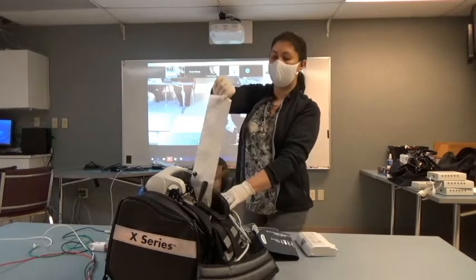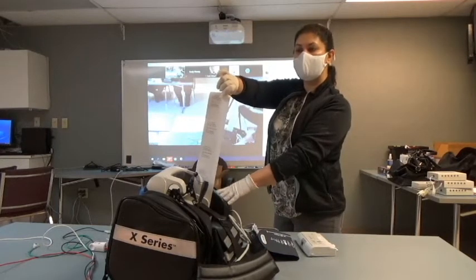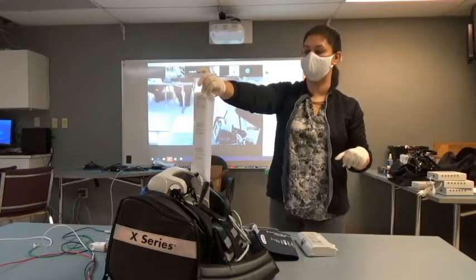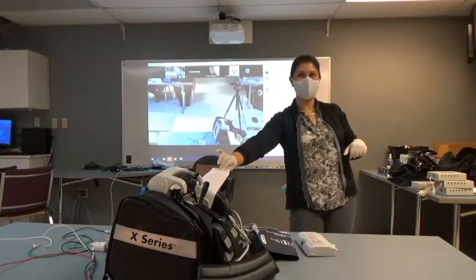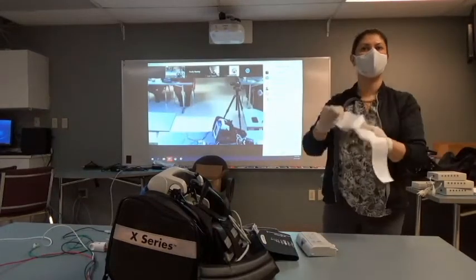You're gonna see that the paper feeds up on the top of the monitor like this. When you go to tear your paper, you wanna hold it straight to the ceiling. You don't wanna tear it to the side. You wanna go straight up to the ceiling and to the back to avoid those paper jams.